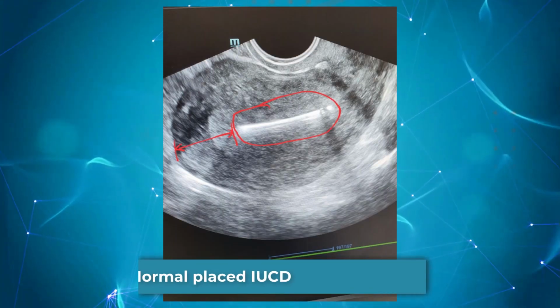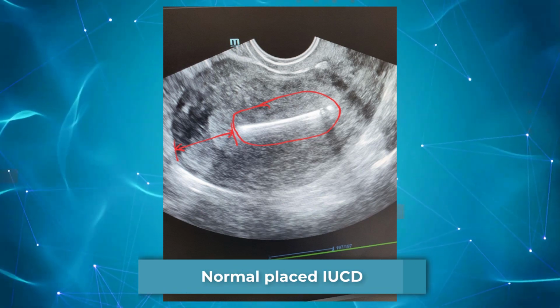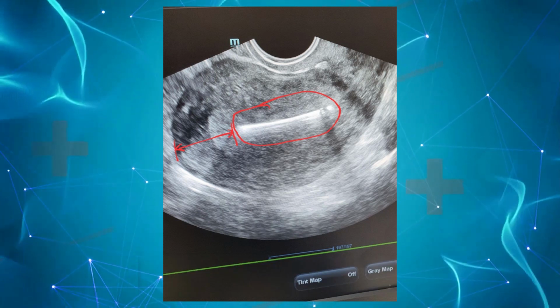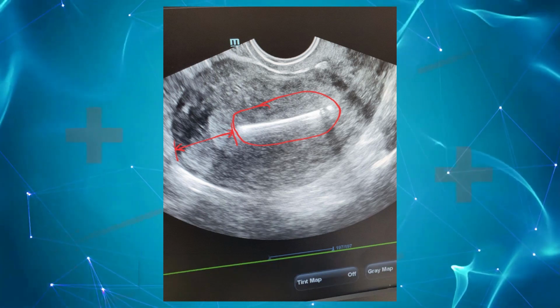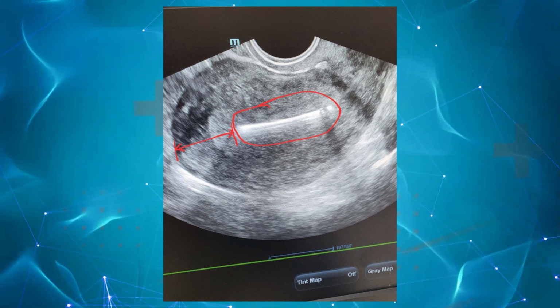So when this thing is placed, make an effort of just doing an ultrasound to make sure that it is in the right position and that it's doing its work, so that at least we can prevent unwanted pregnancies. An ultrasound, I've always said, is a simple procedure, no radiation involved. It's a very fast procedure that can be done immediately, and you can go back to your duties.